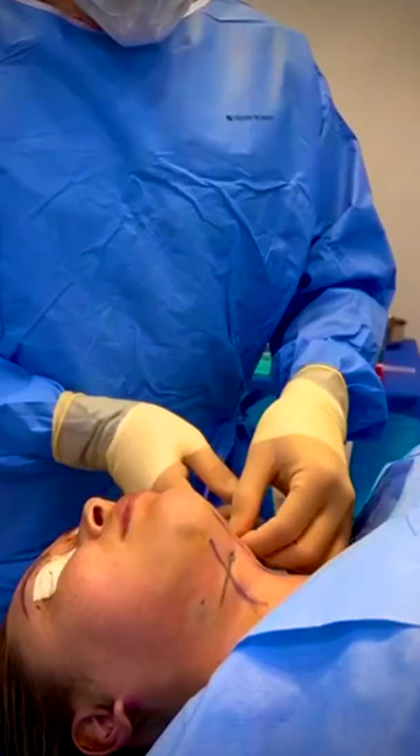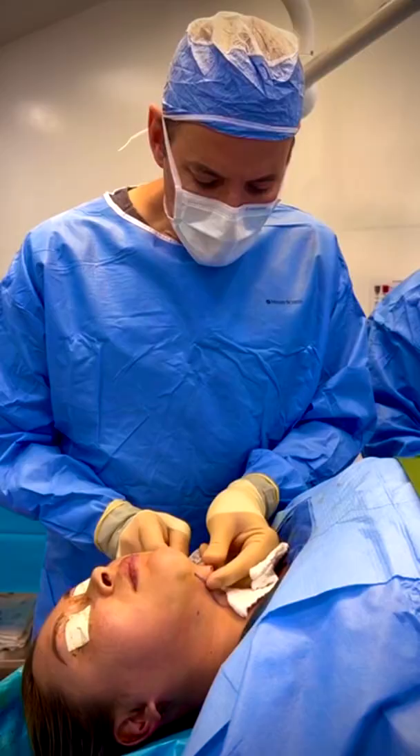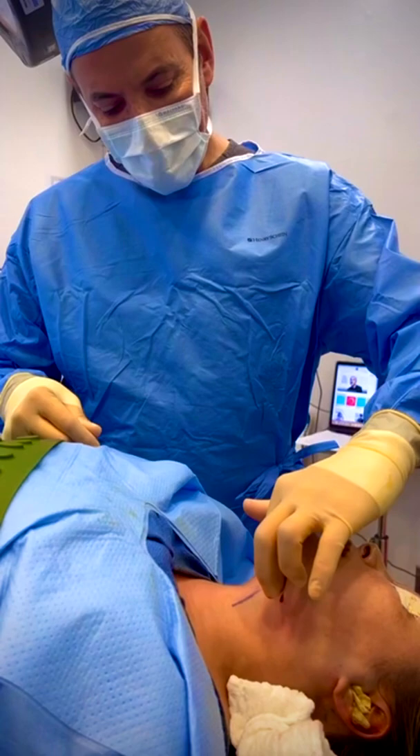You can tell that the muscle's above the rod there. Now I'll just back this out. So we're under the edge of the muscle — now we're going to go over the top of it. I came out, so I just go in the skin here again, now going over the top of it, and use the lap just to pull the skin over. There we go — now we know we're just underneath the skin. So what we're doing now is cutting the band. We use just a little suture like a little Gigli saw. You can see it going right across the front there, making a tiny little cut in the front of the muscle band so that we can give her a nicer angle here.